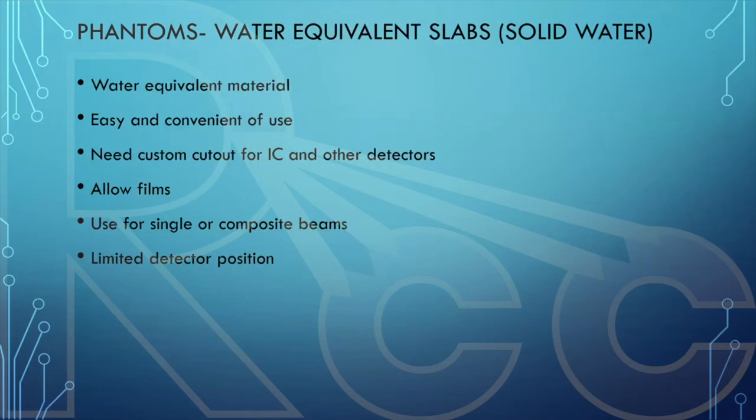Also, you can use solid water. These are water equivalent materials. That's why we call it solid water. They are easy and very convenient to use. However, you need to keep in mind that you need to do a custom cutout for your specific ion chambers and other detectors that you want to put inside the solid water.